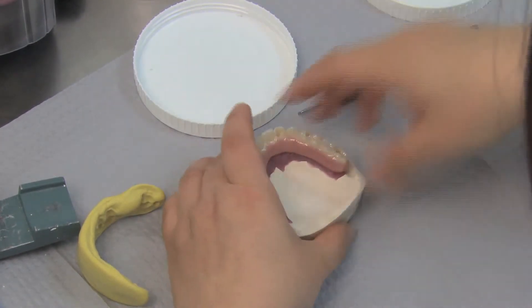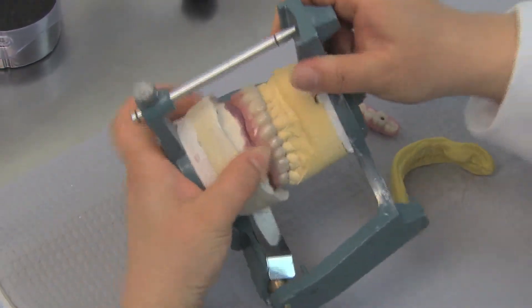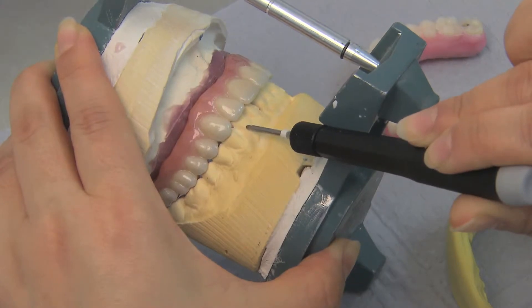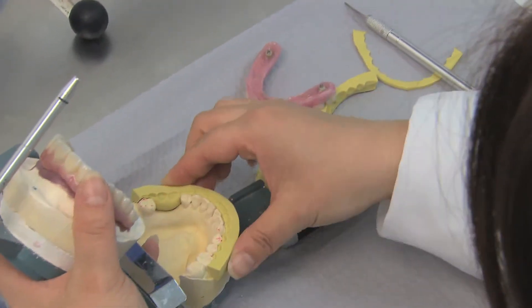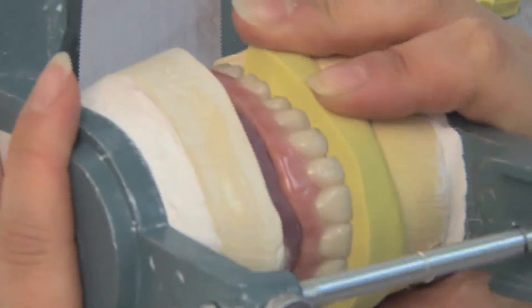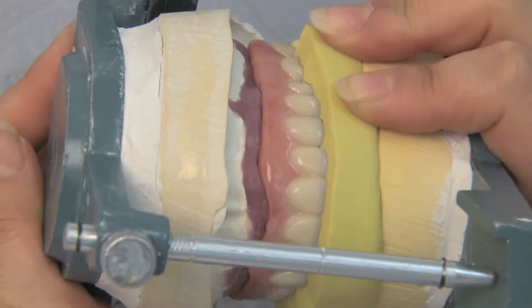Once the final restoration has been fabricated, it is attached to the stone model and the articulator. The bite is checked to make sure the alignment of the incisal edges matches that of the patient's own dentition and is seated correctly. The putty index matrix is then placed onto the closed working model to see if the restoration properly matches the putty, confirming proper alignment and that no discrepancies were found.